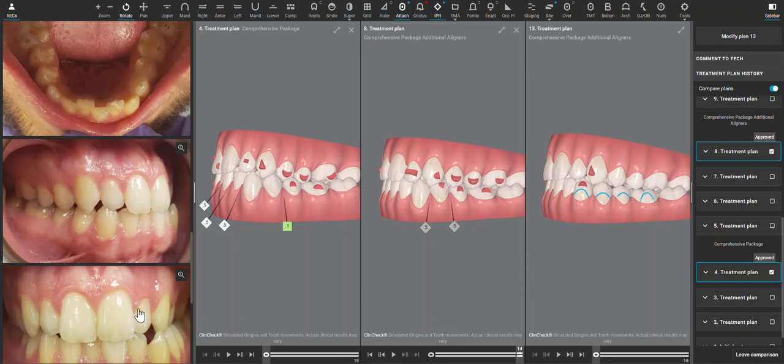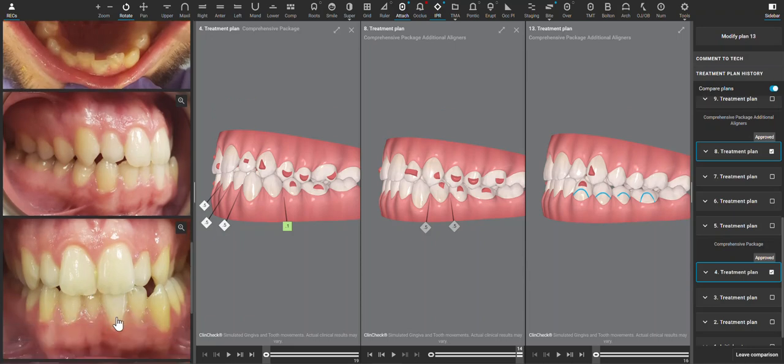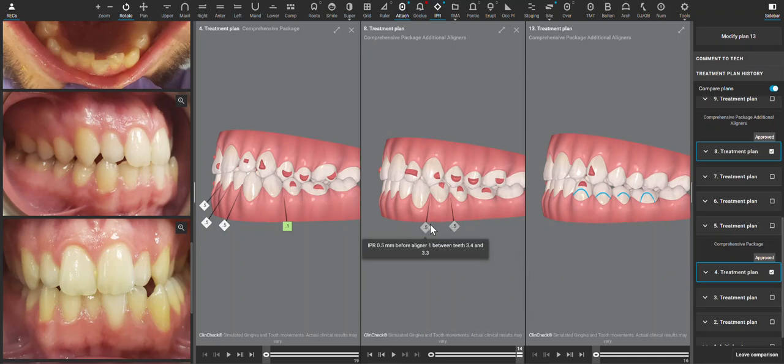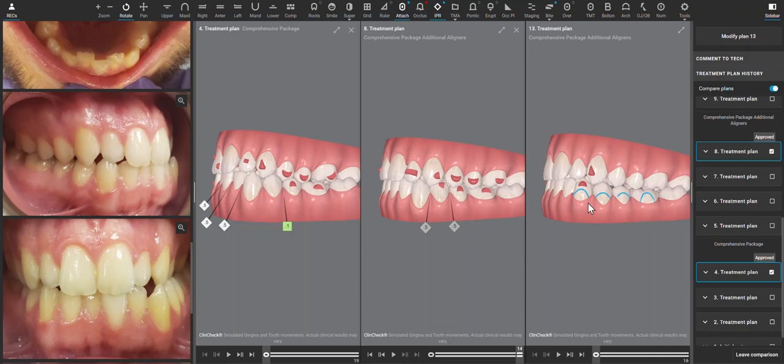But I think trying to restore the upper laterals, make those more proportioned with the centrals, and doing as much anterior IPR as possible—even though posterior IPR has already been done—that realistically is the solution here to try to create some overjet with this patient who's very much Class 3.